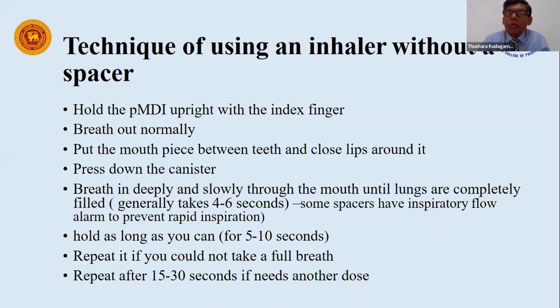This might take about 4 to 5 seconds. Take time, slowly, and deep. To prevent vigorous inspiration, some of the devices have an inspiratory flow alarm. And then you hold your breath as long as you can, at least 5 to 10 seconds, and you may repeat taking breaths in.